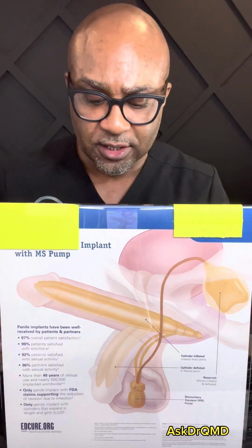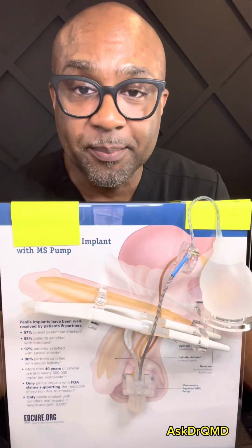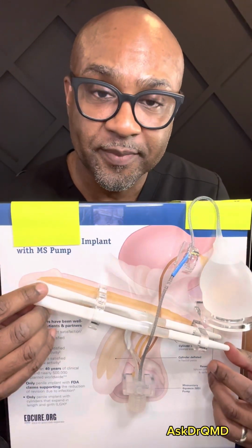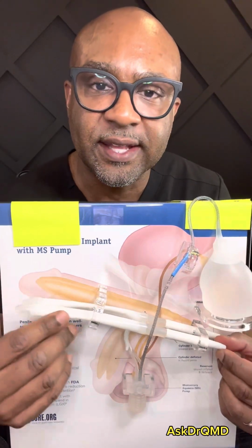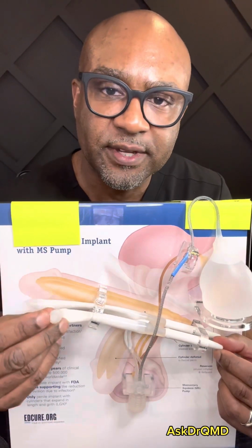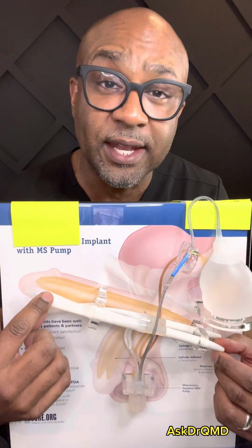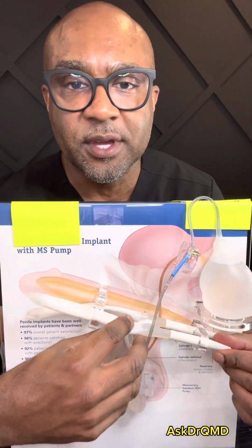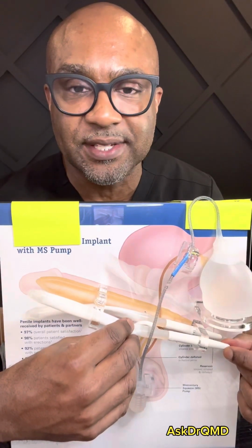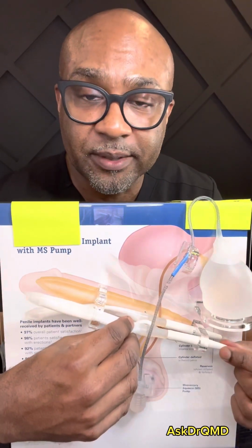So let's look at an actual prosthetic. This is a sample of an actual penile prosthesis. Okay, so you have the cylinders here, and if you look carefully, you see that the shaft of the cylinder is very soft and pliable. The ends are a little different. The tips are harder, and these fit underneath the head of the penis to aid in penetration. And then you have something called rear tip extenders right here. These snap on the end of the prosthetic to fill in the rest of the length that we talked about that goes back to the pubic bone.